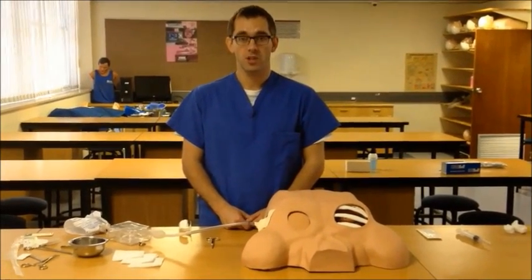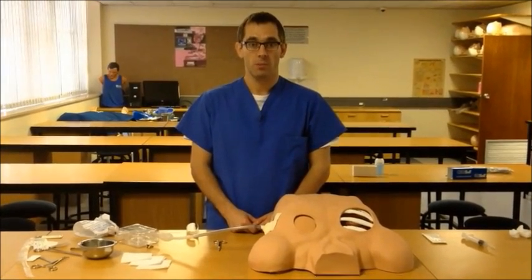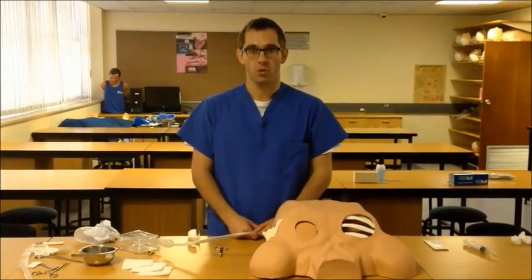For purposes of demonstration I will not be wearing gloves in this procedure as it sticks to the plaster we are using, but please keep in mind that when doing this on a real patient, full universal precautions should be observed.